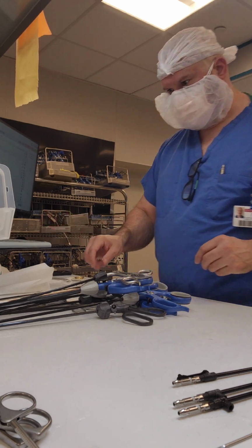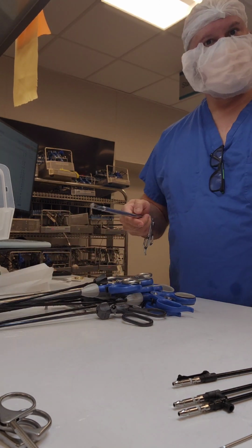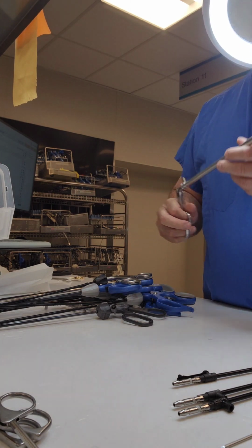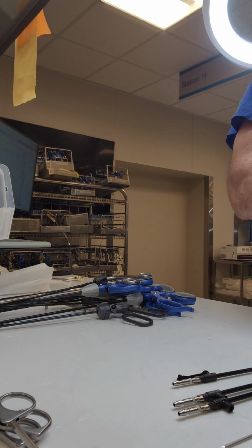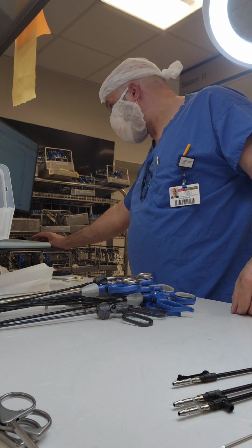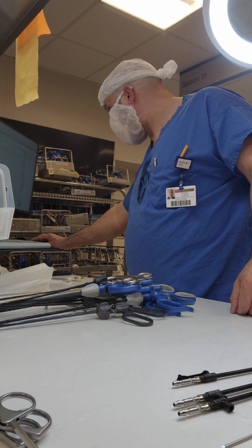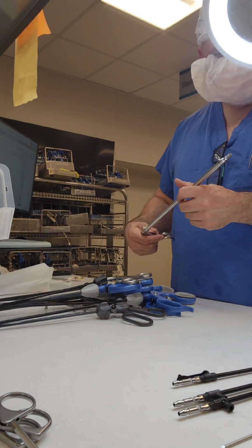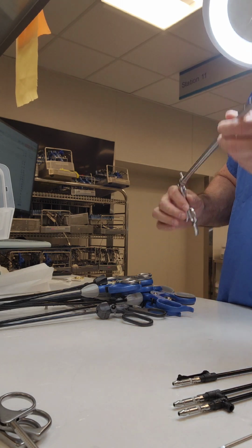Again, laparoscopic sets should not be done quickly. It should actually take you some time because there's a lot that goes into inspecting and testing laparoscopic instruments. Now I'm identifying the instruments, placing them on the rack, checking them off one by one, because you either know these instruments by heart or you don't know the name of them, and you have to check those part numbers.